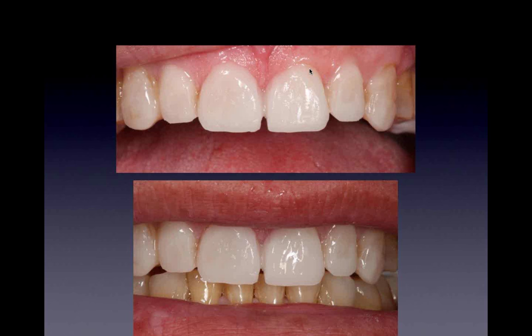Later, if I go back and do the veneers and the crowns, I can go back and just cut this laser back because I probed it. Once you probe 3 millimeters, you know you can take away 1. Your biologic width needs to be 2, 2.5. So anything past 2.5, you can go ahead and laser away from it.